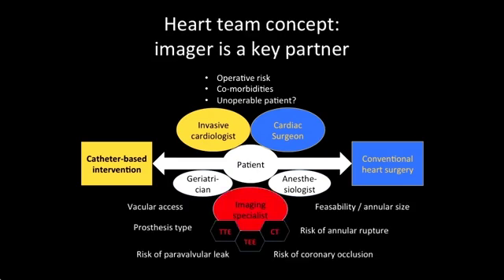By adding an imaging specialist to the team, the specific aspect of the TAVI procedure can be taken into account in this discussion, including the feasibility based on annular dimension, the estimated risk of complications, the vascular access option, and the most suitable prosthesis type.